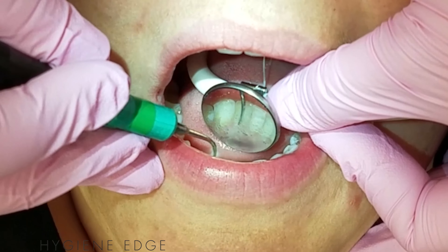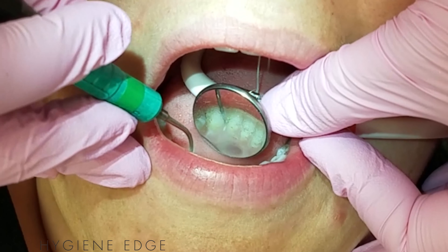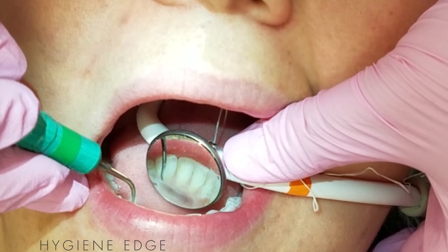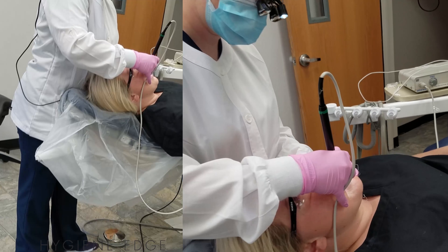On the mandibular anteriors, you can form the saliva ejector in a U-shape along the mandible and move the mirror slightly upward, making indirect vision and suctioning easier in this more challenging area.